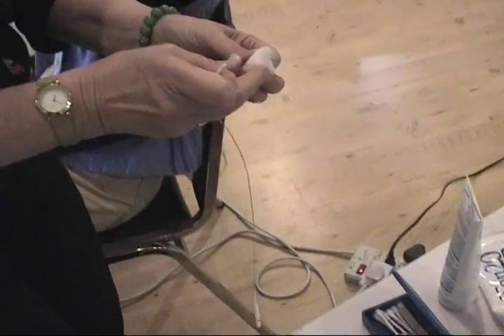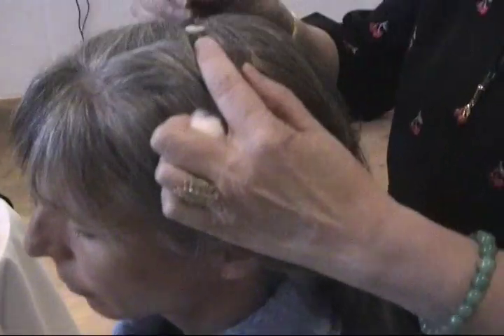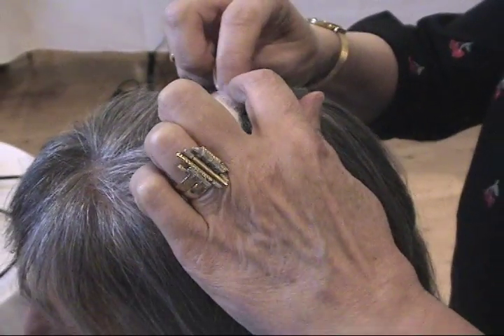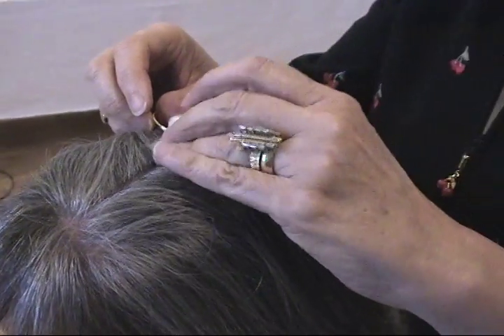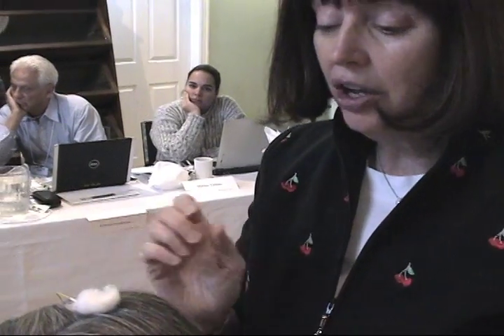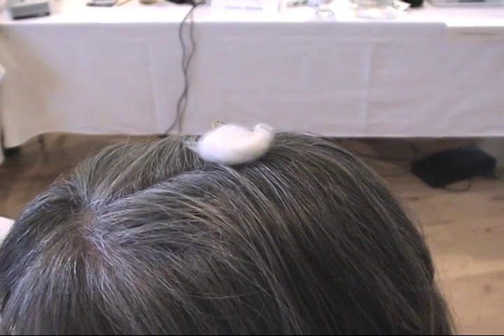I've also got a little cotton ball here. I'm going to put this on the spot that's already been prepped, press it down, and I can use the cotton ball to press it down — that way you don't get as much gel on your finger. The cotton ball is also helpful because during the hour-long session, your gel isn't going to dry out and cause impedance changes.